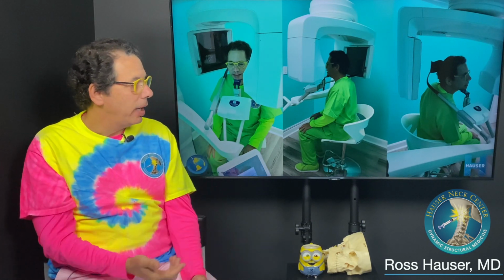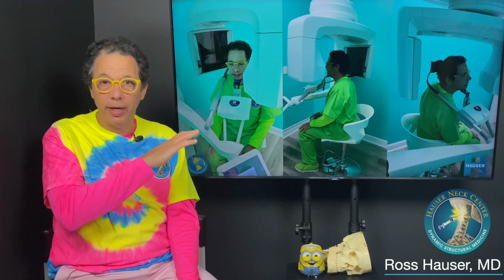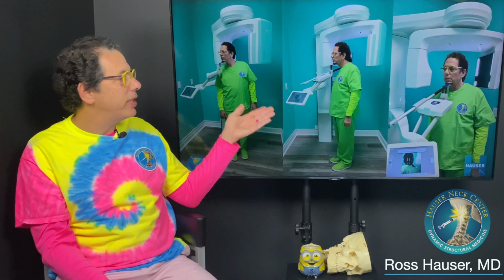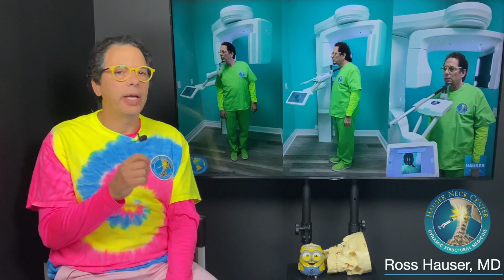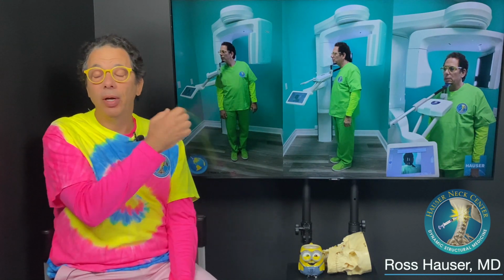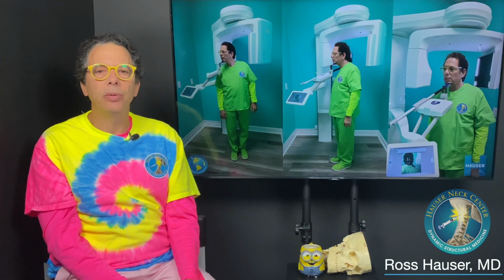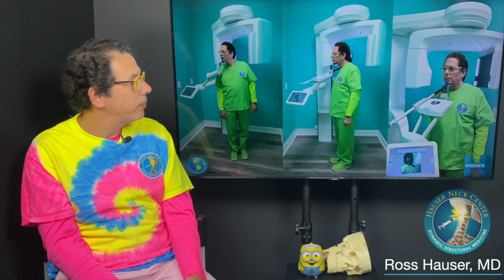The cool thing about a cone beam CT scanner is it's upright, versus a traditional CT scan at the hospital where you're laying down. And this is me standing up. So we can scan somebody when they're standing up, sitting down, and also we can move the neck. So you can see the 3D anatomy of the bones in the neck and the jaw in different positions.